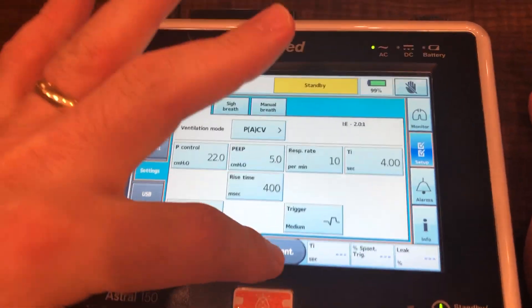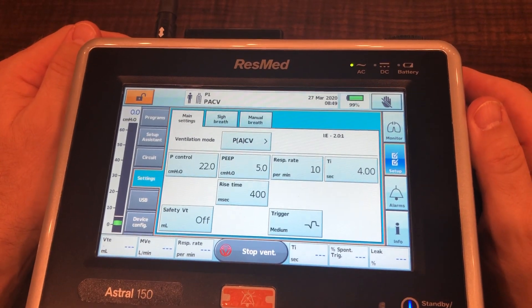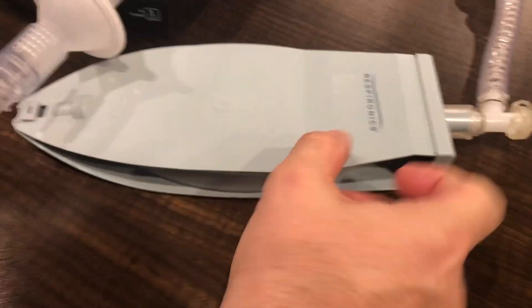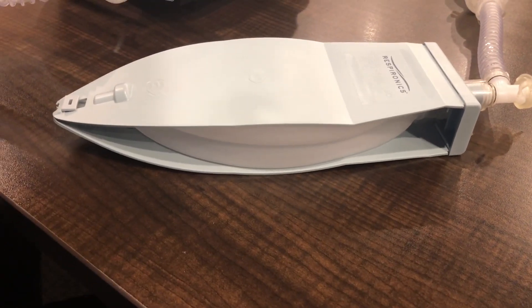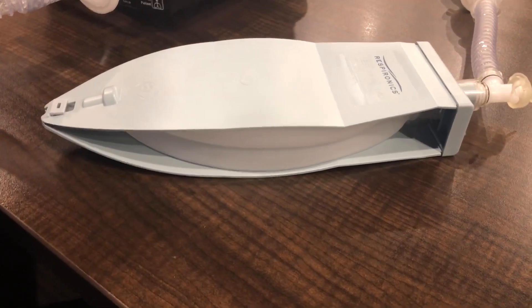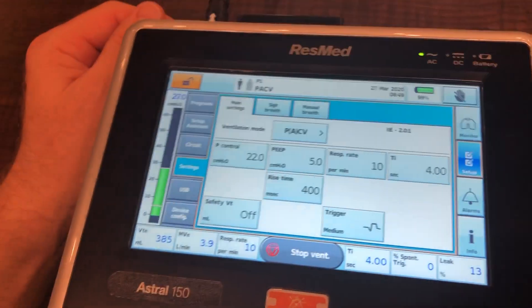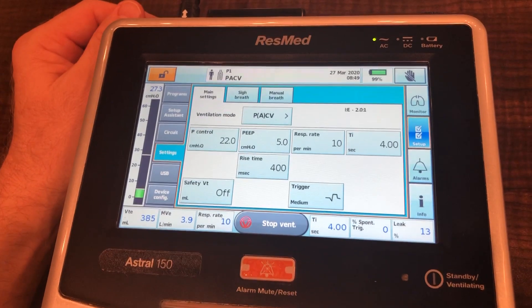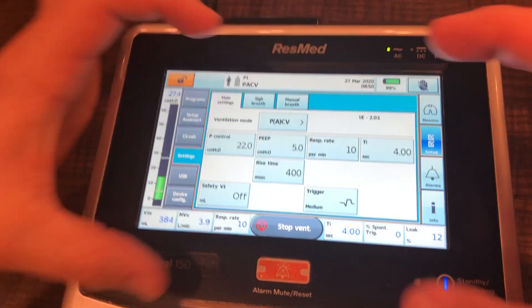I'm going to start the vent now by pushing the button right here, and we are ventilating. You can see our test lung is getting pressure and volume. You can see it's an extremely long I-time, but we understand that this was intentional — for these patients we want to slowly deliver a breath to help them really achieve optimal oxygenation.